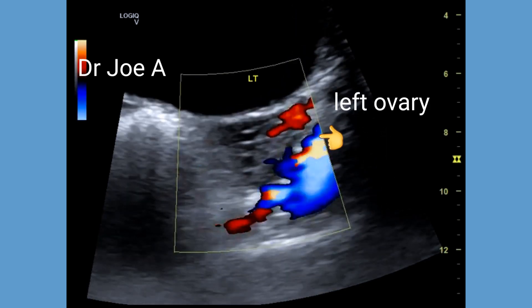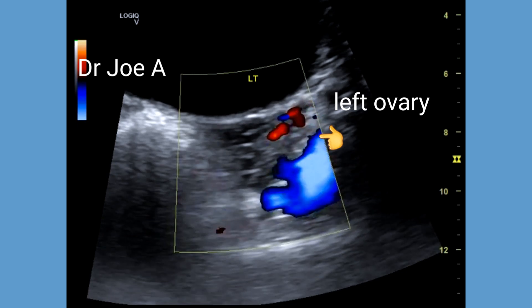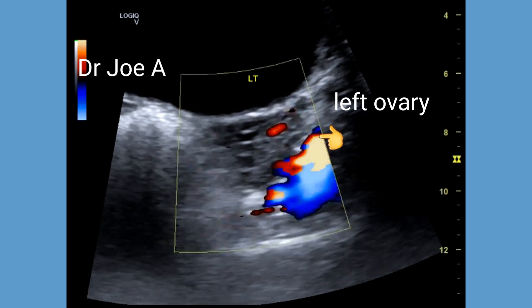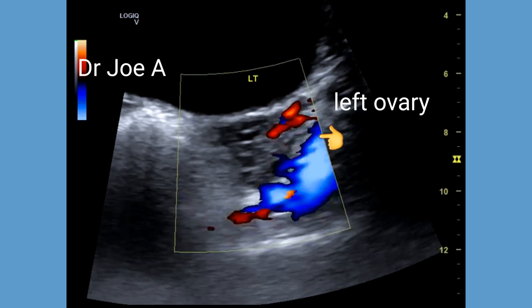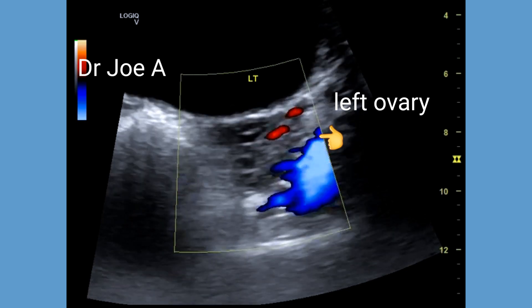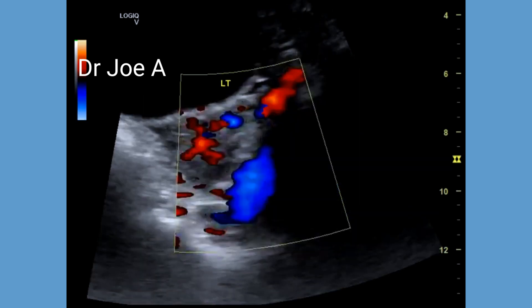Color Doppler shows mild vascularity of the affected left ovary, suggesting partial torsion of the left ovary.